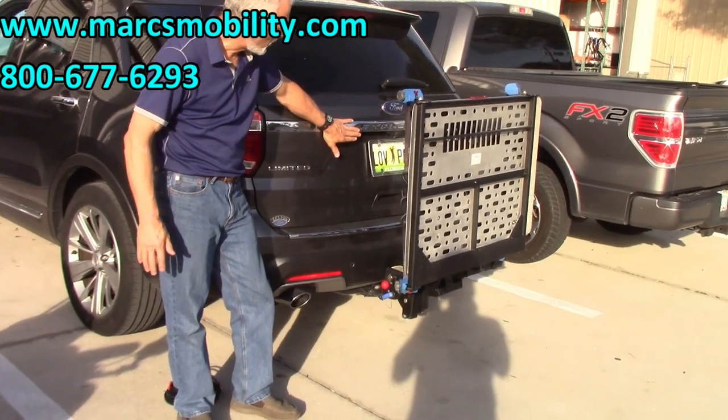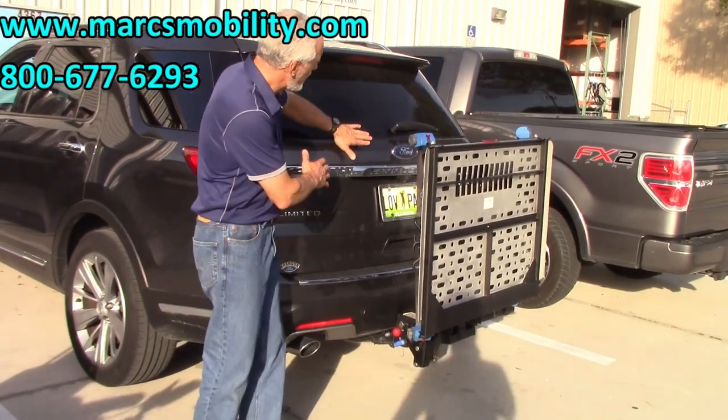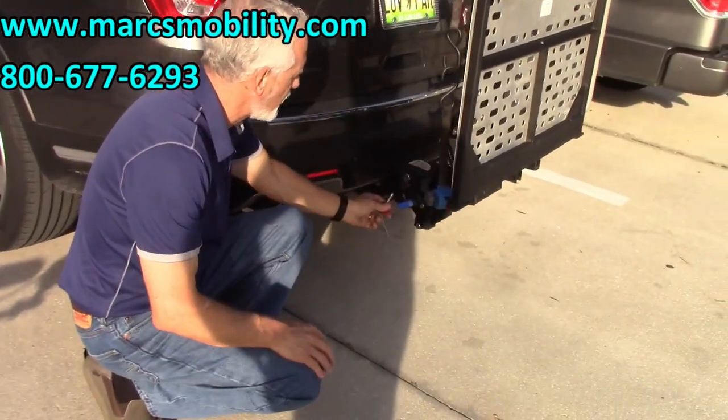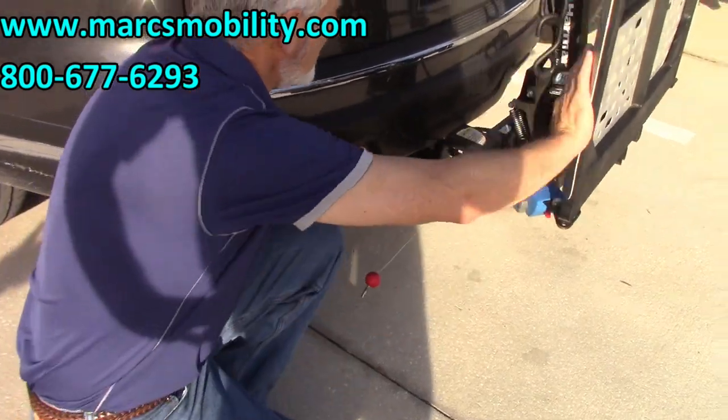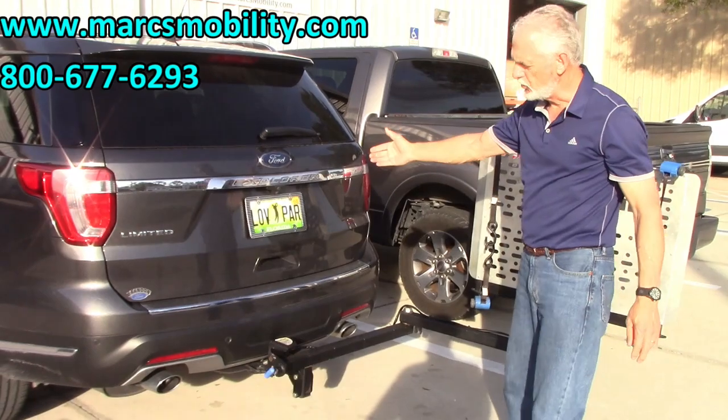If you have a vehicle with a tailgate, an SUV, or a pickup truck and you need to open it, it does have the swing-away. What you do is pull the red handle out, pull the blue handle back, and push it away from the vehicle. Then you open your door.